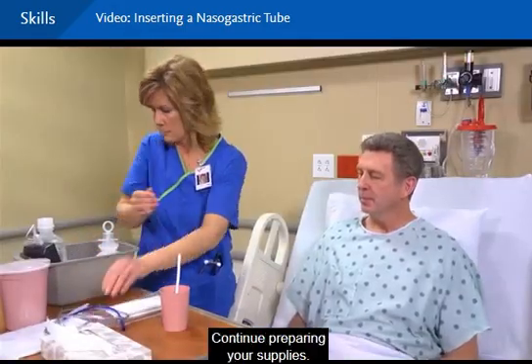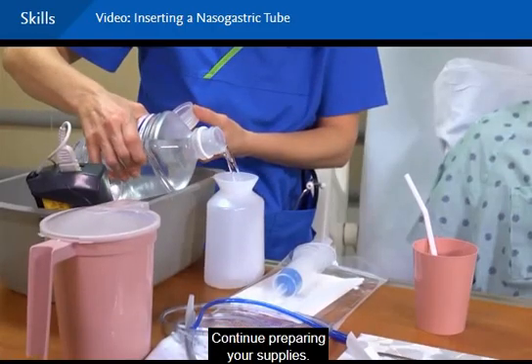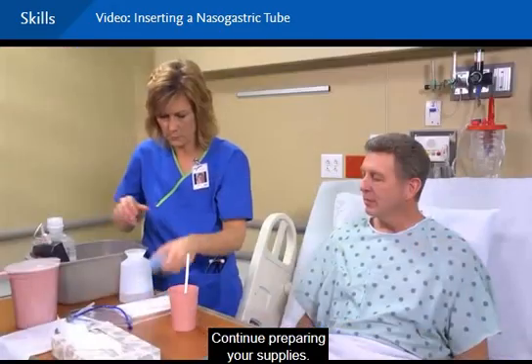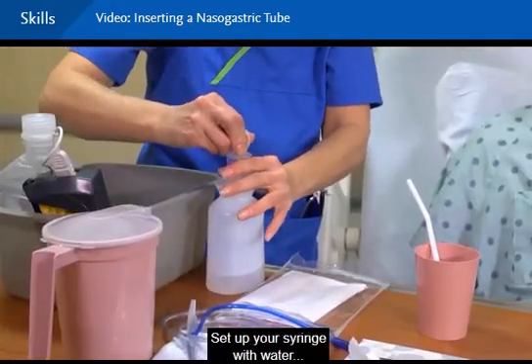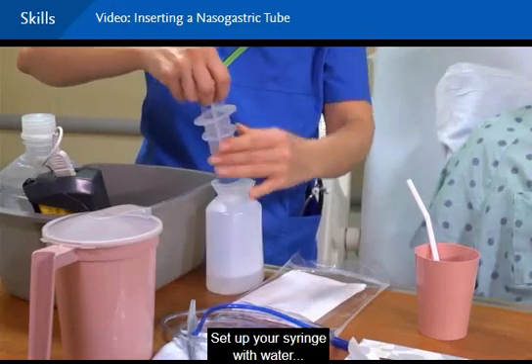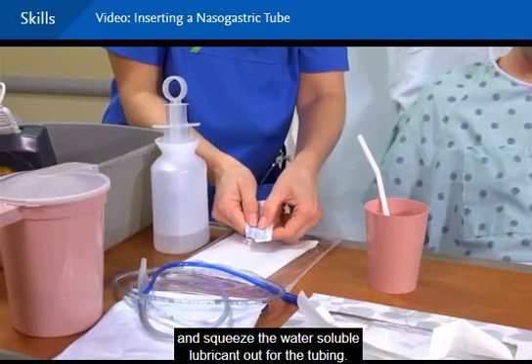Continue preparing your supplies. Set up your syringe with water and squeeze the water-soluble lubricant out for the tubing.